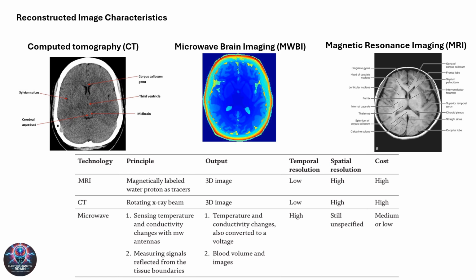MWBI devices are compact and can operate outside traditional hospital settings, offering great potential for mobile diagnostics and monitoring in remote or resource-limited areas. In contrast, CT and MRI require large, stationary systems, as depicted in their respective images. Each technology also has distinct applications.